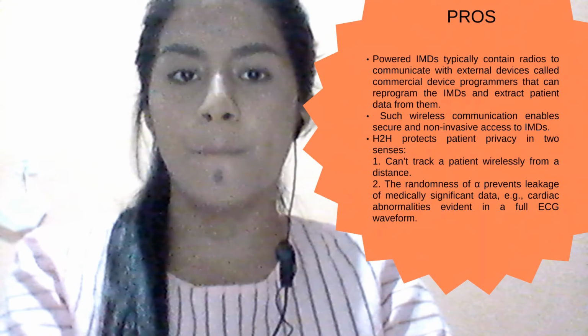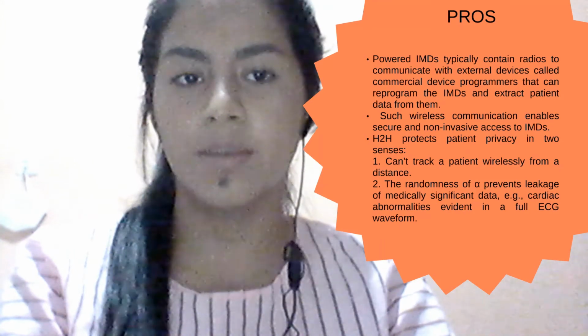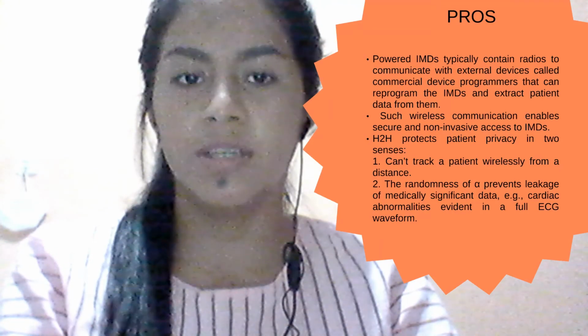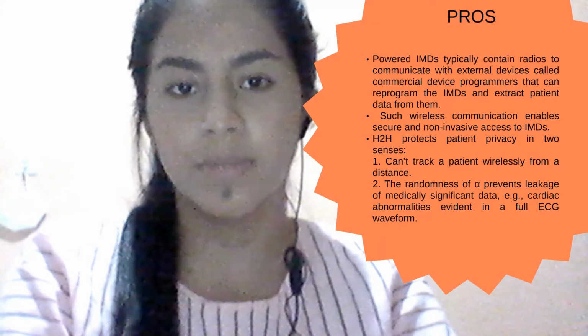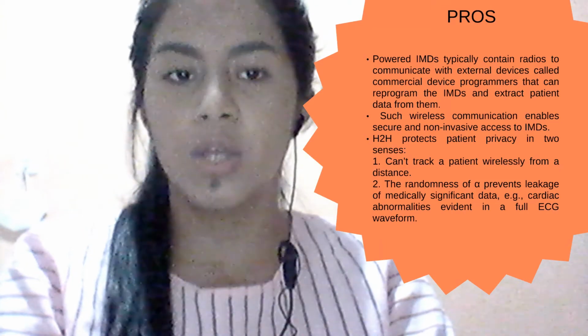Pros. Powered IMDs typically contain radios to communicate with external devices called commercial device programmers that can reprogram the IMDs and extract patient data from them. Such wireless communication enables non-invasive access to IMDs.